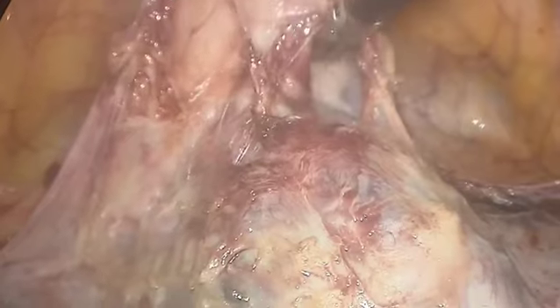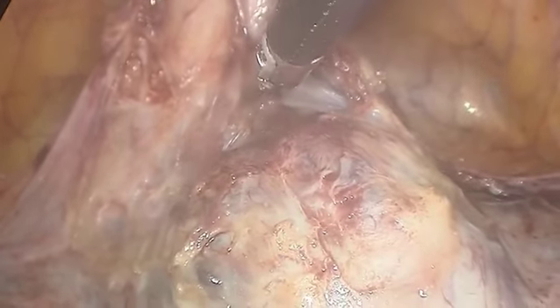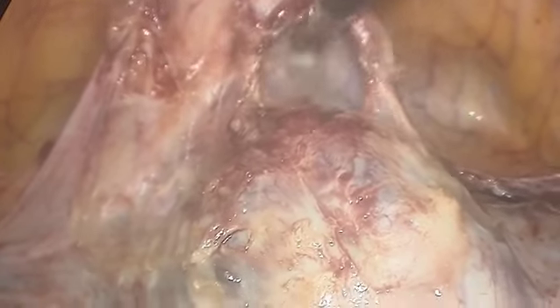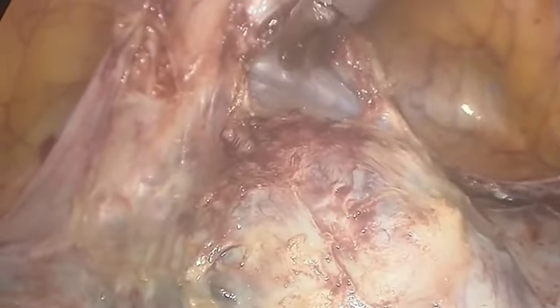Step 4. The dissection is carried down until the anterior cervix is visible. This step gives us a safe workspace to excise the scar without risk to the bladder.